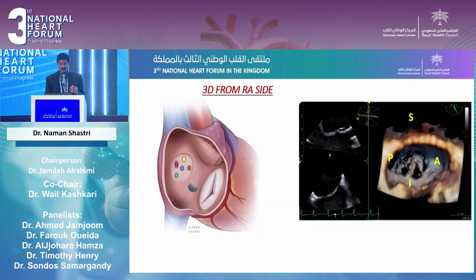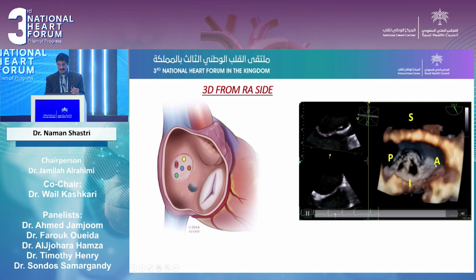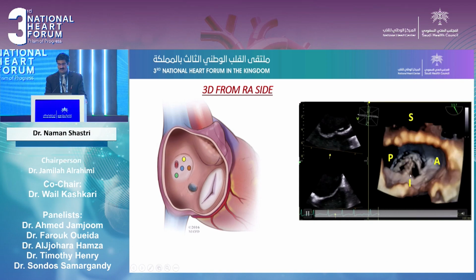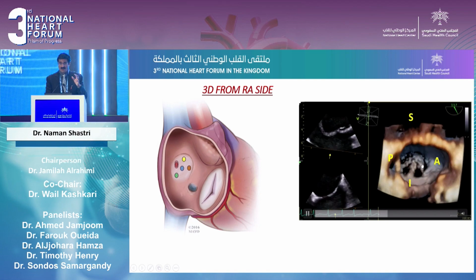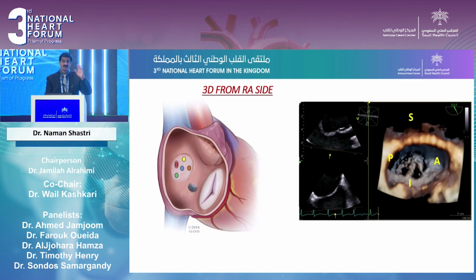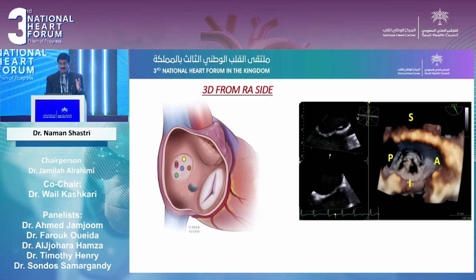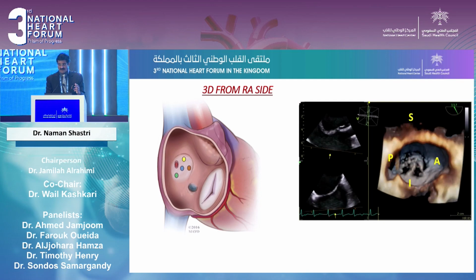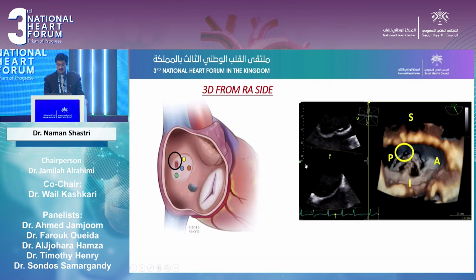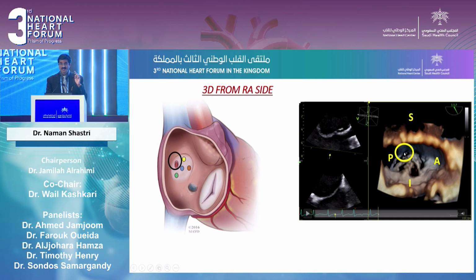So this is how we look at the right atrium. You can see that this is the aorta, so this is anterior, posterior, this is superior and inferior. Sometimes they may have a large ASD, or part of an ASD which was left alone from previous cases, and that also has to be clearly mentioned. And usually they puncture at this level, that is mid to superior and a little posterior. So this is exactly the site of the puncture which has to be shown.